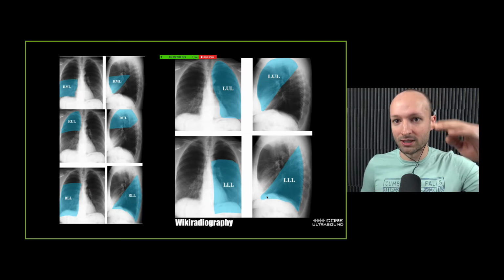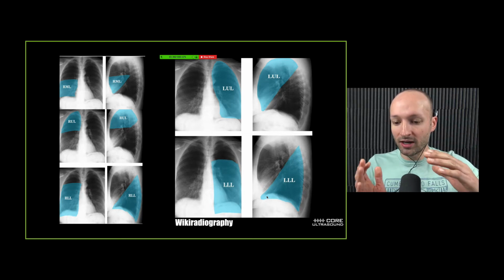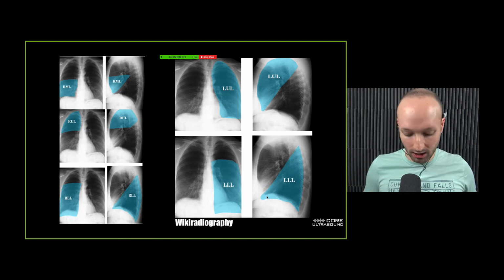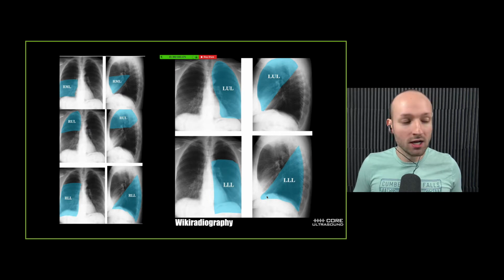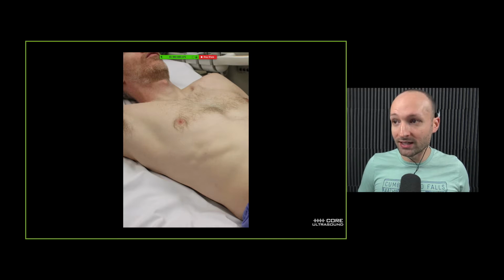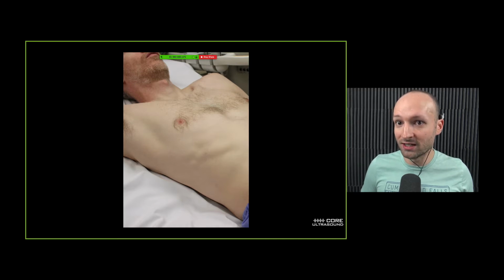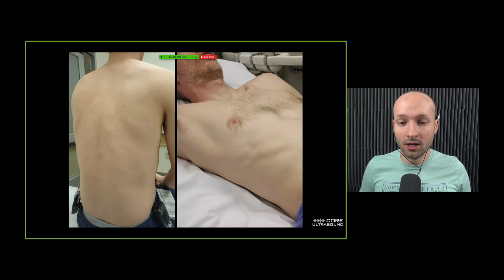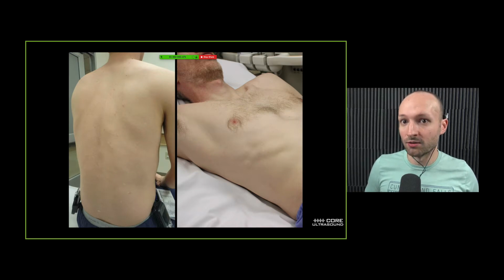So don't think about the lobes as like from top to bottom. Think about them as almost staggered in a diagonal orientation. So to look at the lower lobes, you have to look at the back of the chest. And that's kind of the extra thing with lung infections that you need to look for. So you definitely can start the examination like this, especially if your patient's intubated, but you have to look at the back part of the lung. Super important with these potential lung infection patients.